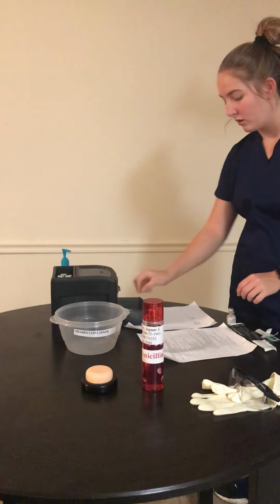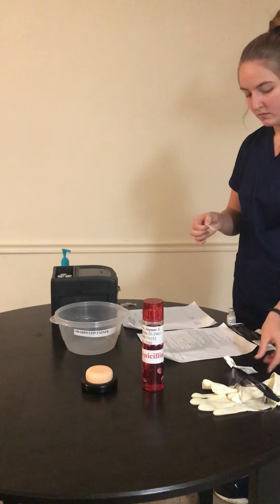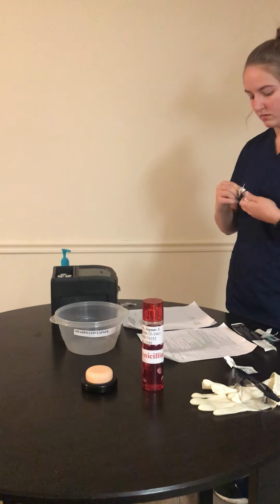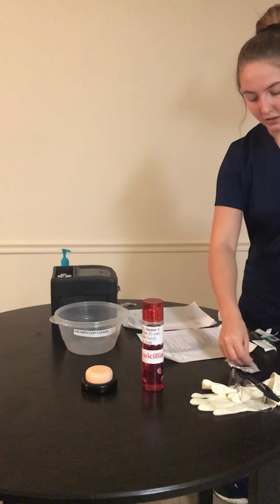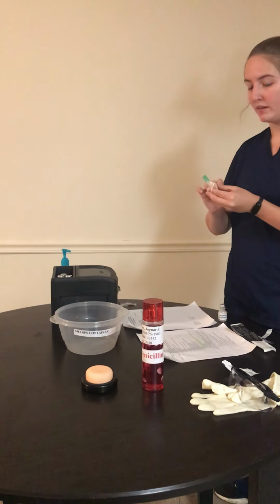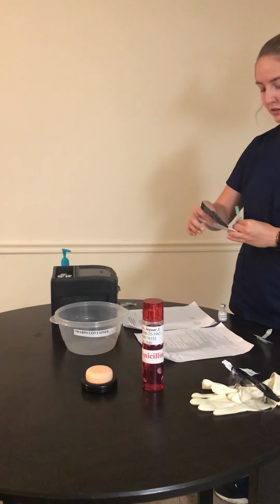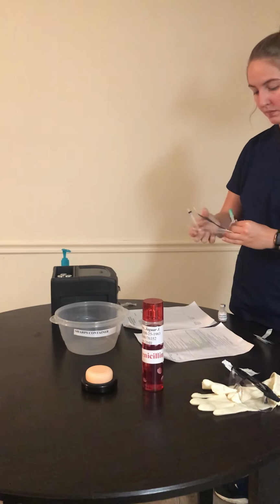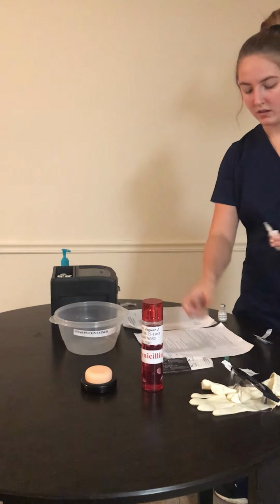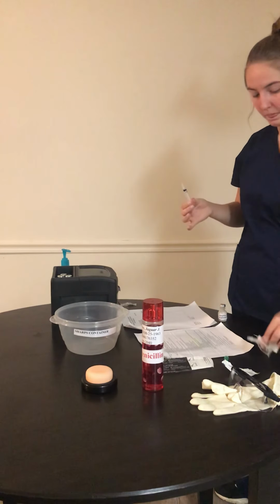So to withdraw, I'm going to get my alcohol swab and clean the vial. After I have cleaned the vial, I'm going to remove my blunt cannula while maintaining sterility and open my 3 milliliter syringe. I'm going to take the top off of the blunt cannula and place it on to my syringe and lay it down.